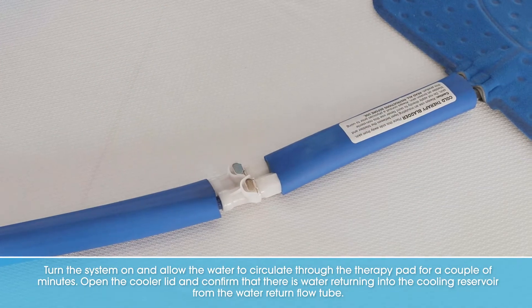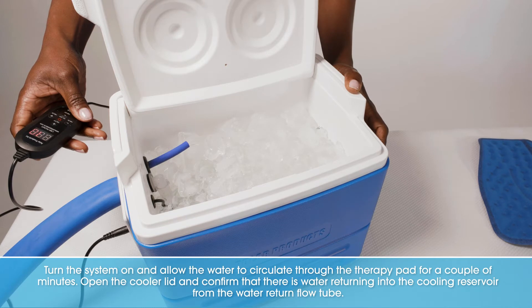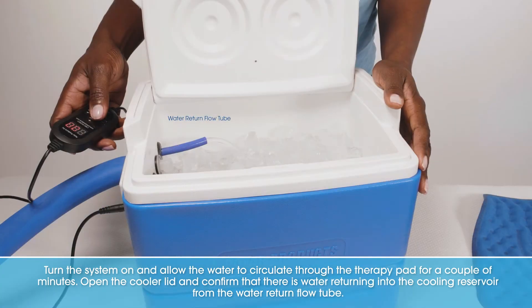Turn the system on and allow the water to circulate through the therapy pad for a couple of minutes. Open the cooler lid and confirm there is water returning to the cooling reservoir from the water return flow tube.